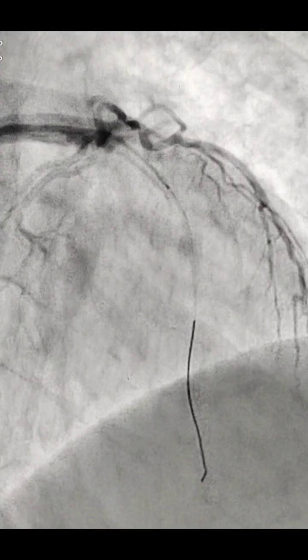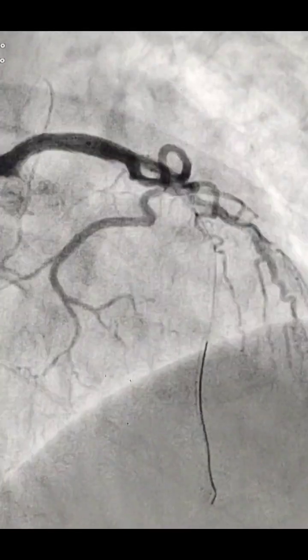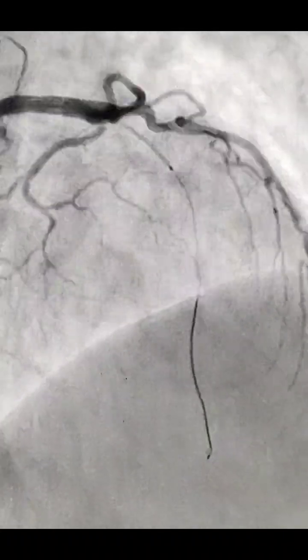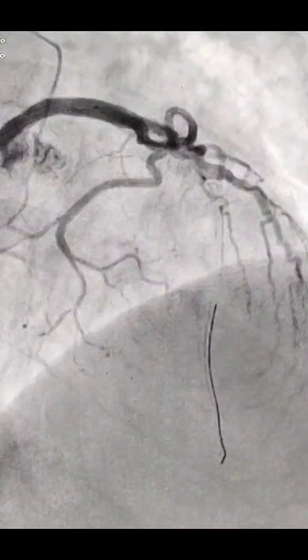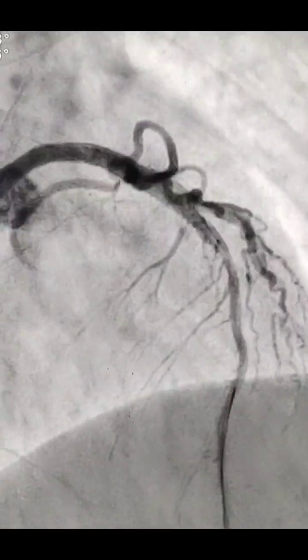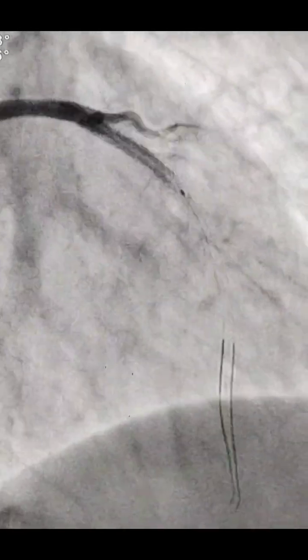And you see this is the placement, and I was checking the position of the stent, and meanwhile the patient got VT because there was no flow at all. Then we gave a shock, and the VT reverted, and then inflated the stent as early as possible. This was the inflation. Nominal was 8. We inflated up to 12. And this is a scene after the stent inflation, and you can see the balloon is still there.